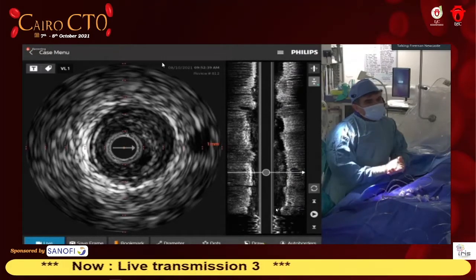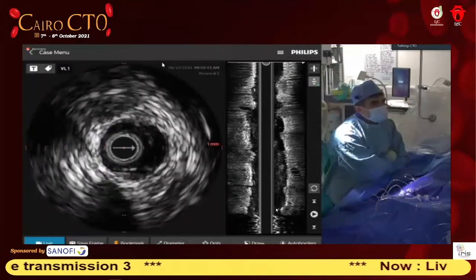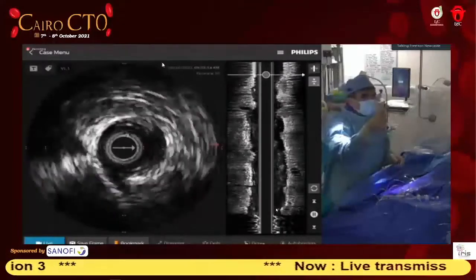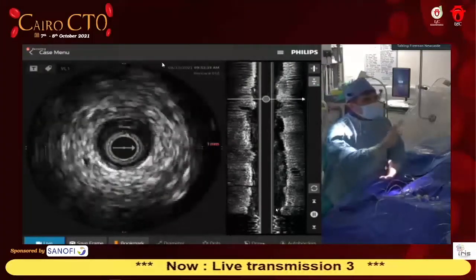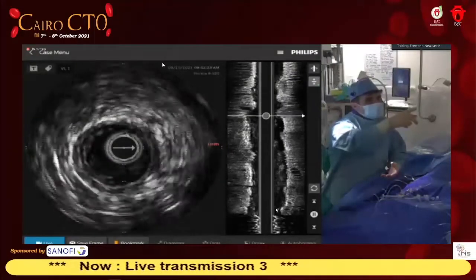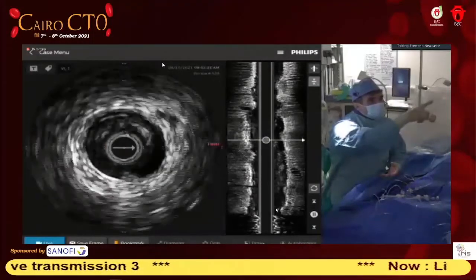So go back with the IVUS, start from the beginning. Let's go back on the IVUS on the camera, please. The anatomic rule is that the right coronary is the same diameter all through till the bifurcation. Can you see the IVUS now? Yeah, we see the distal now. So it's negatively remodeled, it's underfilled, so it will grow, no question about this. We're going to come to the hematoma, which you'll see about 3 to 6. Here you go, we're starting to see it. Can you see it from 12 to 6? Yeah. This is the hematoma we saw in there.